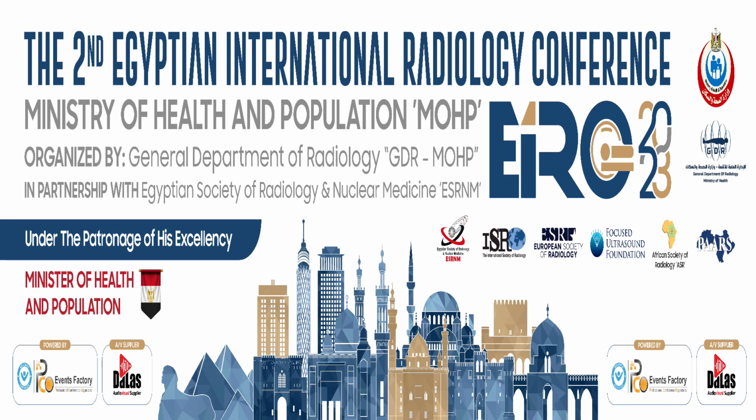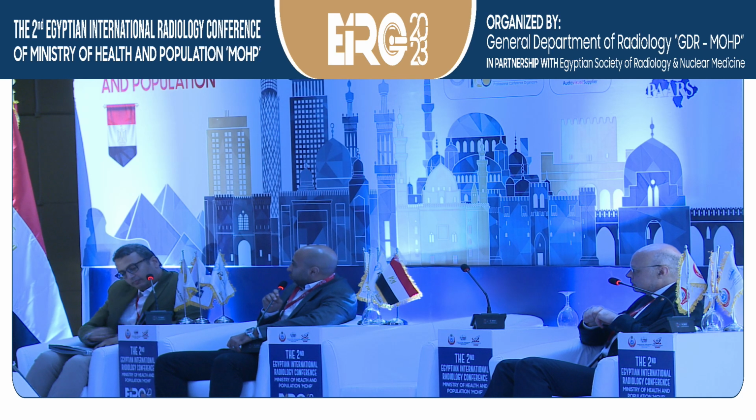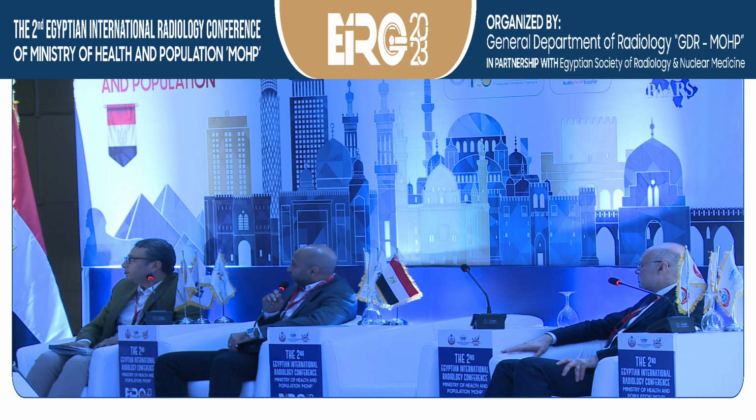Thank you, Dr. Dina. Any questions? Thank you, Dr. Dina, for this presentation. But I have a couple of questions. The first one is about the oral contrast in the scan. You use it for exclusion of leakage, and in the pre-contrast scan, you use effervescent for the dilatation of the stomach, right?